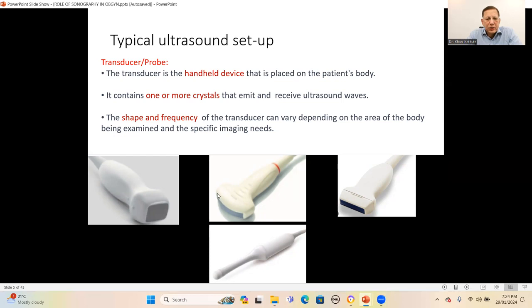The curved linear probe has a somewhat curved surface and is used for abdominal imaging, fetal imaging, and gynecological imaging. The high-frequency linear probe is used mainly for vascular studies. The intra-cavitary probe is used for transvaginal scanning and transrectal scanning.